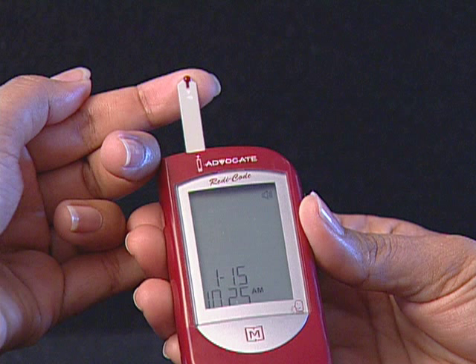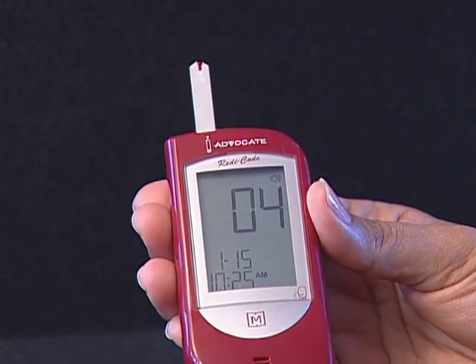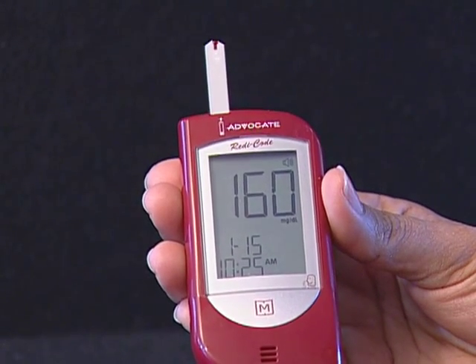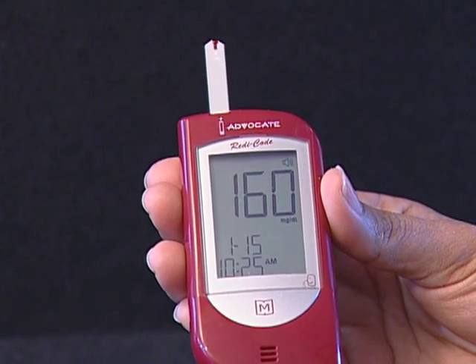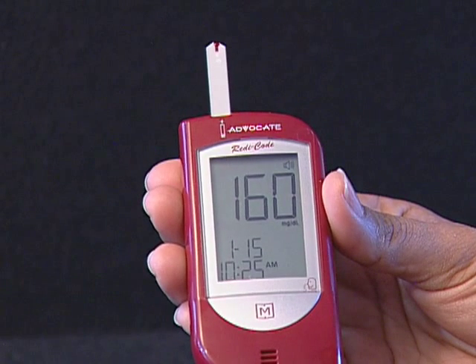It is important that the blood should completely fill the confirmation window before the meter begins to count down. The meter then begins to count down automatically. Make sure you don't push your finger when it has blood on it against the test strip or try to apply a smeared sample on the test strip. If you do not apply a blood sample to the test strip within 3 minutes, the meter will automatically turn off.